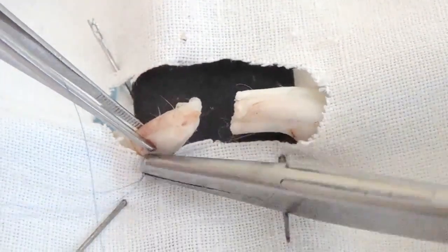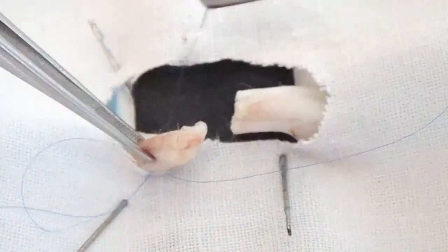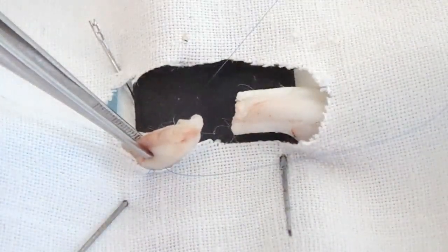Such manipulations are repeated two or three times to provide the filaments coming out from the end of the tendon.